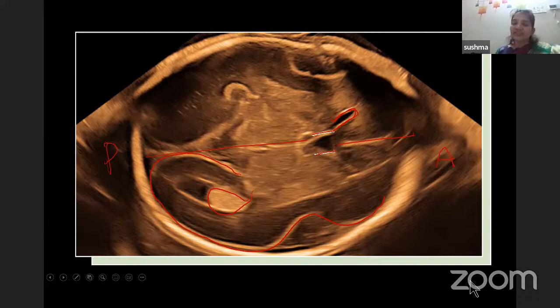So now, what are the features that we saw in the lateral ventricular plane? Apart from the cranial vault, the midline falx, CSP, and CSP is flanked by the anterior horns of the lateral ventricle. And here we can see the posterior horn of the lateral ventricle with choroid plexus in it and the outline of the occipital lobe of the brain. And we have learned that the mantle is hypoechoic.